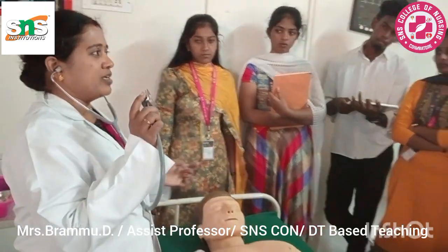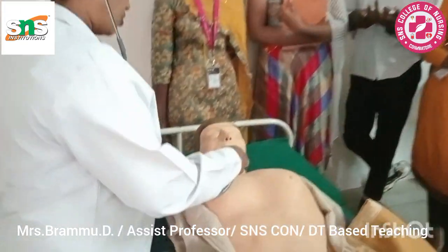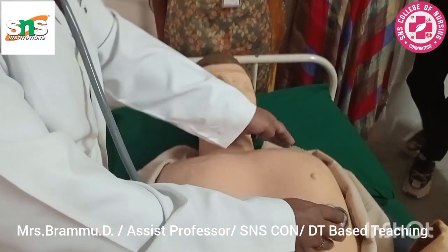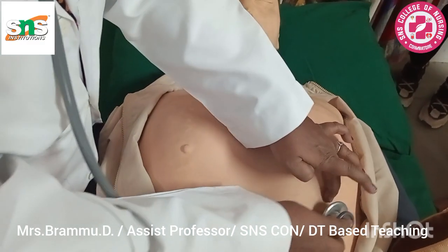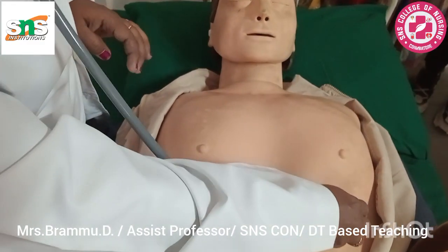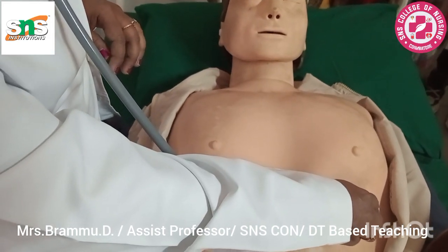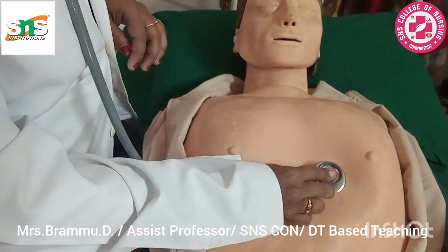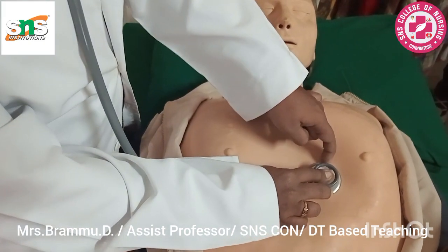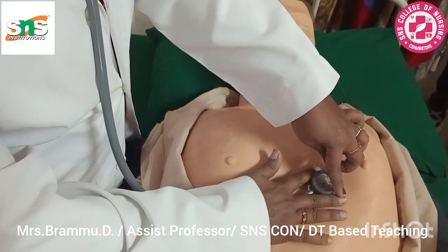Then you have to assess whether it is on or off just by giving a small touch over your diaphragm. Then the first, that is the fifth intercostal space, mid clavicular line, is your mitral valve. So you listen for 1 full minute. Then followed by that, you are going to assess the fourth intercostal space, left sternal border, which is your tricuspid. So you have to hold the stethoscope like this.